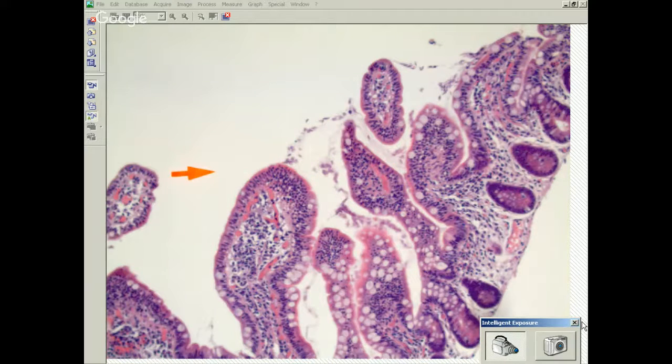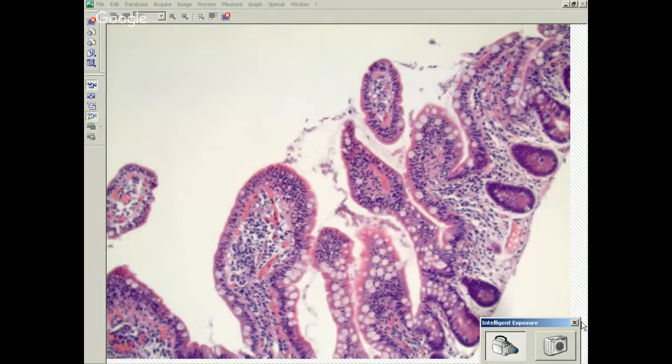And also this entity. Did anyone see what this was? There are those pear-shaped stuff on the surface, right? Actually, this pattern is called falling leaves. So Rifat knows what this is, but anybody else? Yeah, it's Giardia. It's actually a very high infestation of Giardia.